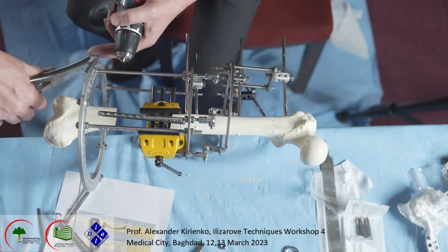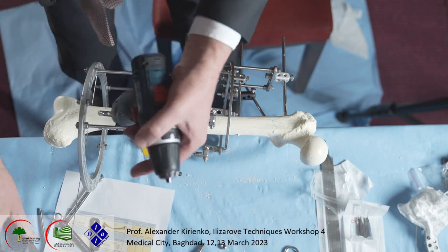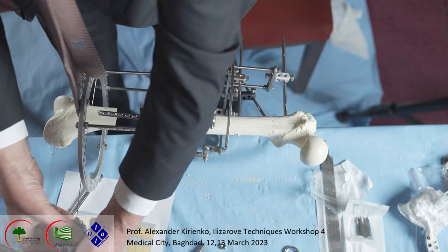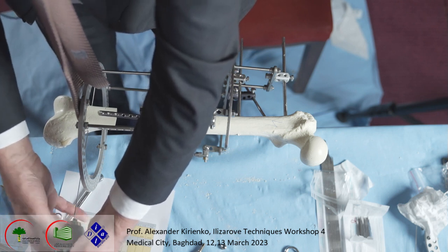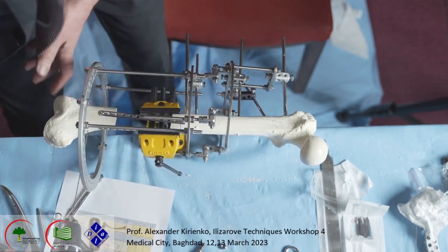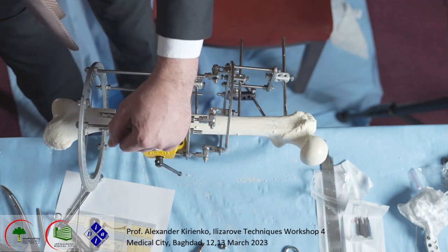You cut the wire oblique, attach here, control the knee like this, the wire goes like this.